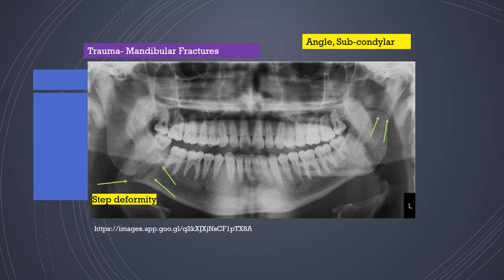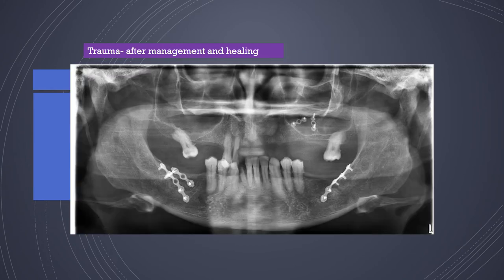Moving on to trauma — panoramic radiographs are very useful when looking at trauma cases. This is an example of a mandibular fracture with an angle fracture on the right side and a subcondylar fracture on the left side. Clinically, you would be able to palpate a step deformity at the angle fracture. Post-management imaging shows bone plating done in multiple areas, and the bone has healed well — the metal plates will remain in the patient's bone permanently.